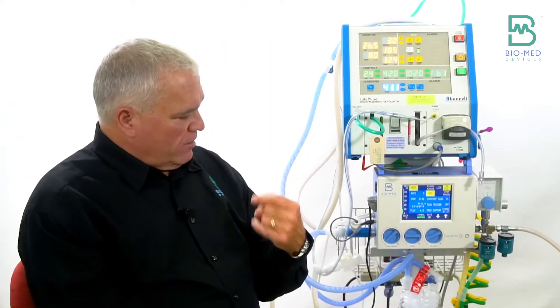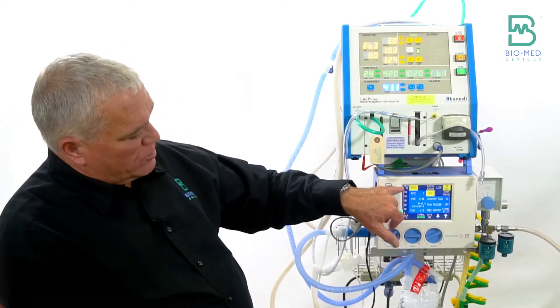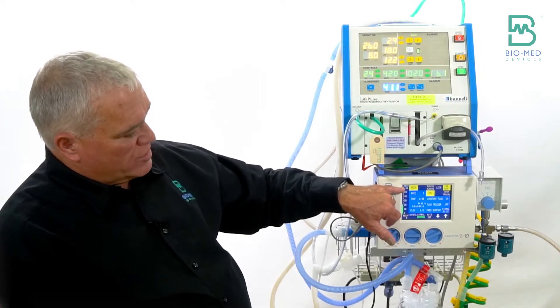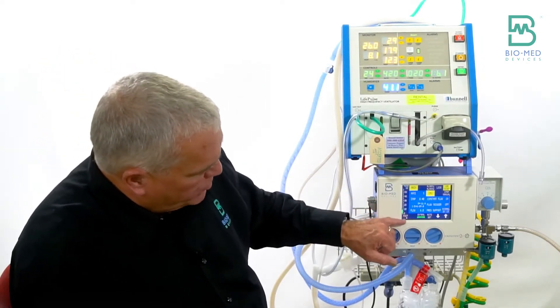If you get a disconnect and reconnect, rather than waiting for those two breaths, if you hit alarm quiet, or switch to CPAP and switch back, you force the number to update right away. Similarly, for peak pressure, after a breath happens the bar graph shows it immediately, but you still have to wait for the second breath before the numeric display updates. Always wait for those two breaths for the numeric display to reflect the correct value.